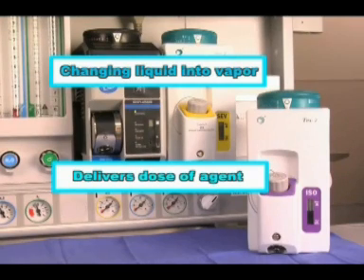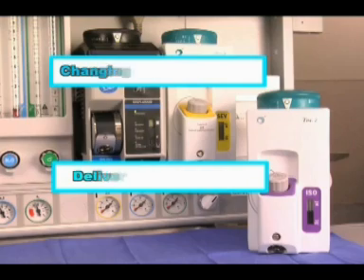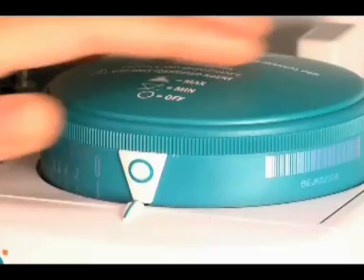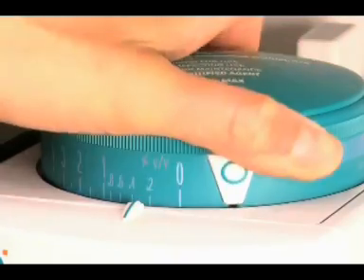The internal mechanisms of the Tec vaporizer consist of features that provide a system of checks and balances to help maintain flow volumes, temperature, and pressure, which allow delivery of a set vapor ratio. Flow volumes are controlled and maintained by the concentration dial of the vaporizer.